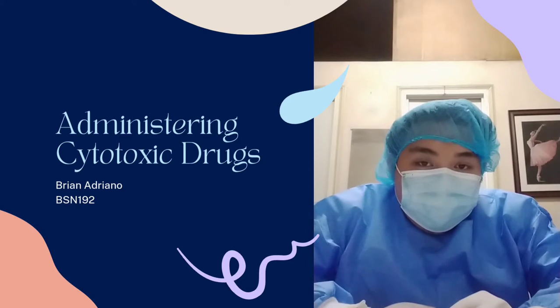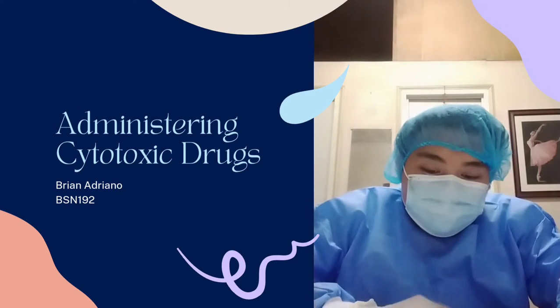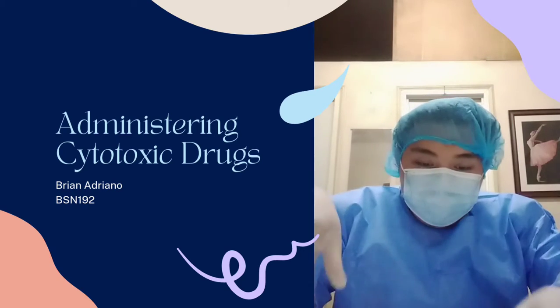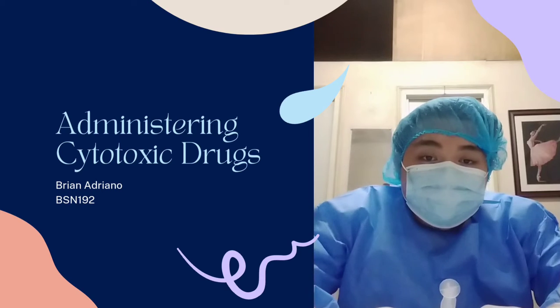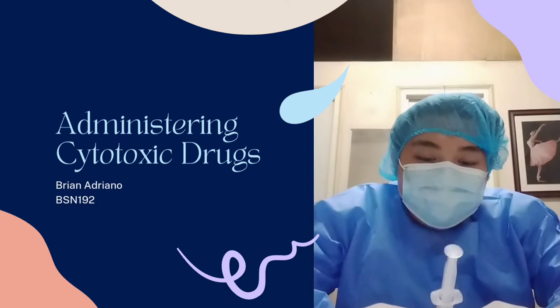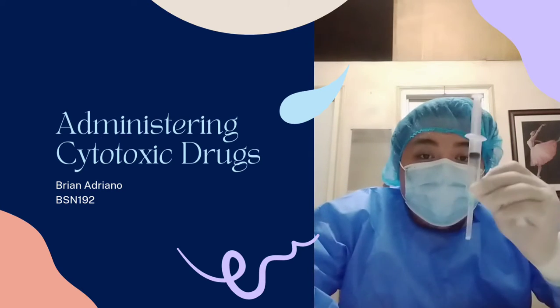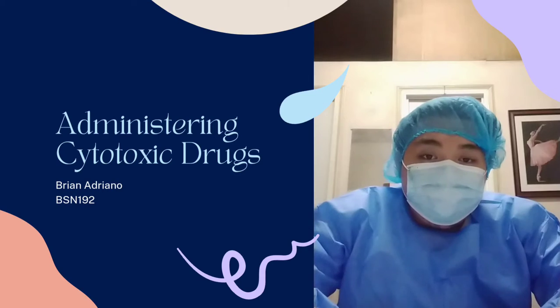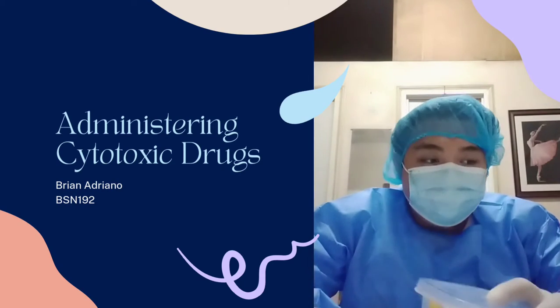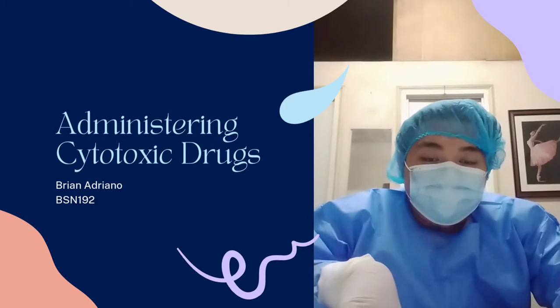The materials needed are the IV line, assuming that this is an IV line and IV port, and also the drug itself, the cytotoxic drug that the physician ordered to be input to the patient, the syringe for the IV push, an alcohol swab, assuming that this is an alcohol swab, and a kidney basin for the discard of the alcohol or the cotton balls.